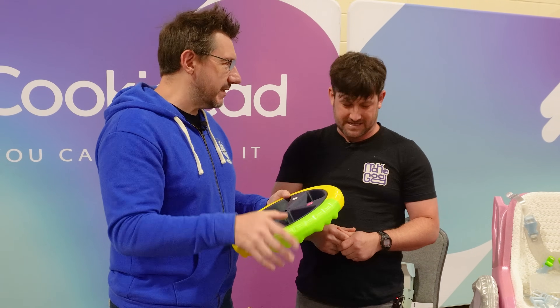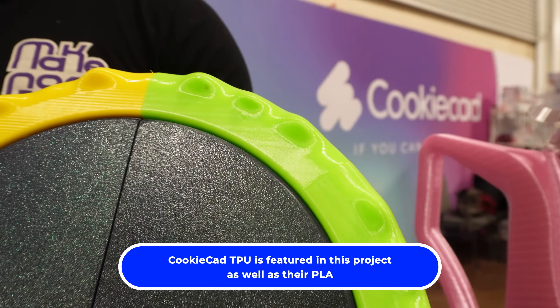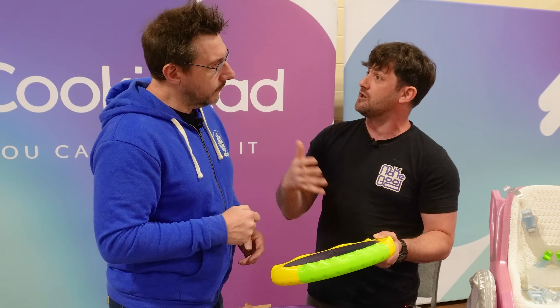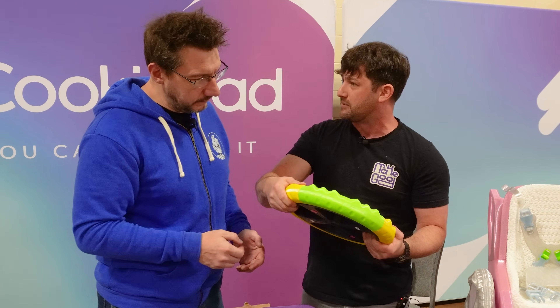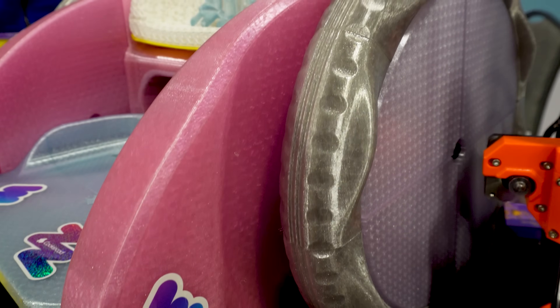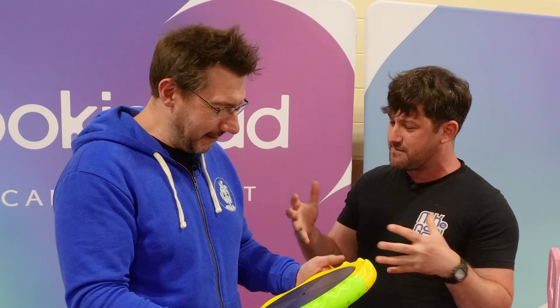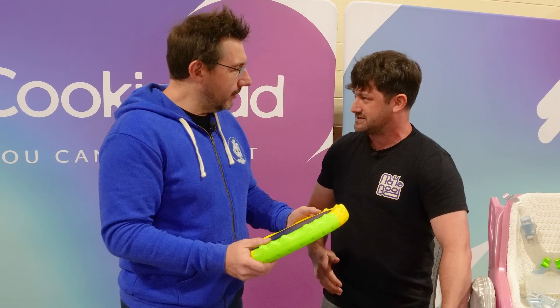TPU being very robust and resilient. And our designer Philip designed these almost push rims, instead of an actual push rim you would see on a big wheelchair. A lot of kids don't have the dexterity for those — they end up just grabbing the tire. So can we give them something besides just the blank tire to also grab? That's so cool. And that's what's amazing with 3D printing — you can really make any shape. It opens up possibilities that just didn't exist for these kind of devices.